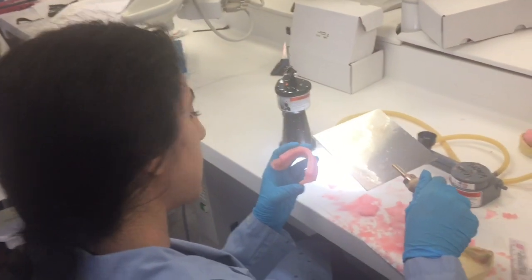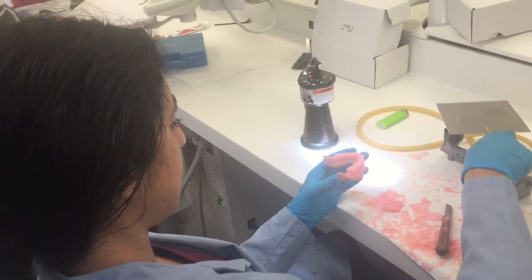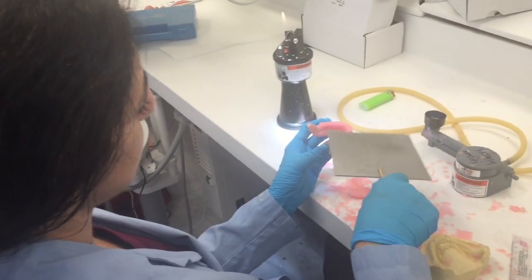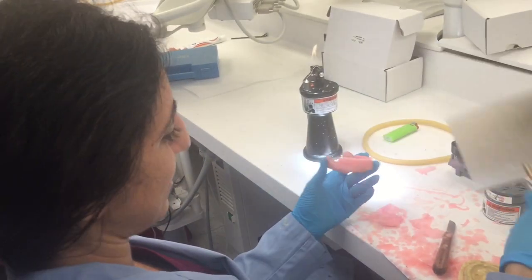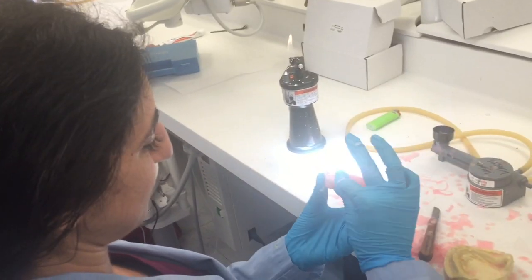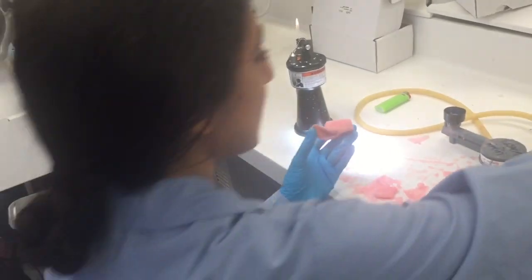Yasmin, yes, thanks. Can you tell me what you're doing? I'm making a wax rim for dentures. Can I have a close look at that please? So basically, this one's my ugly one.